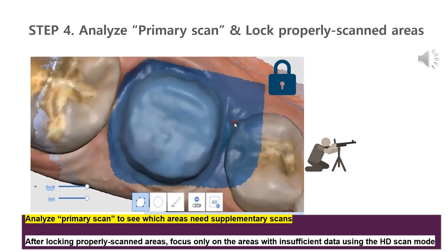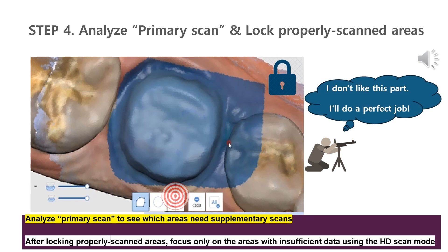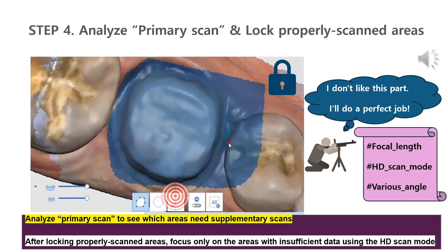Step 4: Analyze the primary scan to see which areas need supplementary scans, after locking properly scanned areas. Now it is time to evaluate the results of the primary scan. If the contact areas are not properly obtained, it is better to completely delete the scan data and perform the primary scan from the beginning — rescanning multiple areas will only result in inaccurate data. If the contact areas are well obtained, lock them with the lock function. The same applies to the body and margin if the data is well obtained. Expose only the parts that are insufficient so they can be scanned.